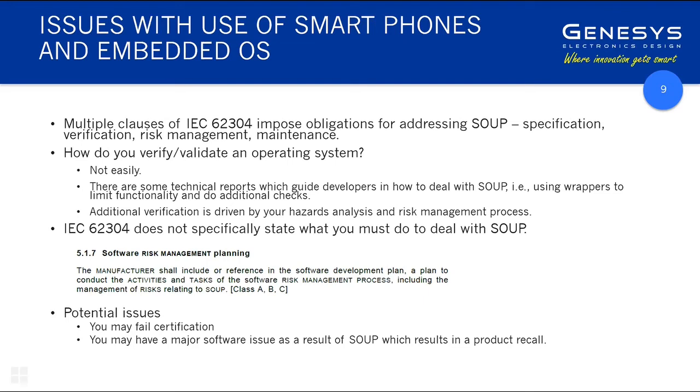Now, what does that really mean? Well, in Genesis's case, we strive to avoid using SOUP where we can in the critical aspects of the design, avoiding some of these higher end SOUP-based displays. You can get LCD screens and touchscreen LCD screens that are completely controlled by a microcontroller.